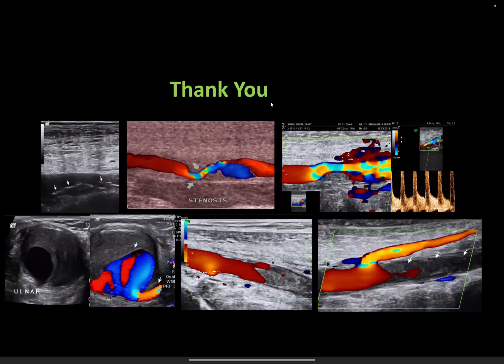What is the difference between duplex and triplex Doppler? Is there anything like triplex Doppler? Basically only B mode was available, then color Doppler and then the spectral pulse wave Doppler. Initially we called it pulse wave Doppler, when we can sample the blood vessel through the sampling gate or range gate and elicit the spectrum without color. It is a duplex, and now color is also available.